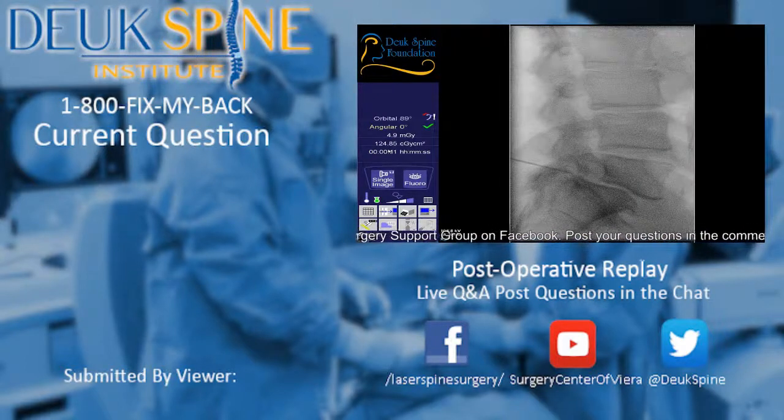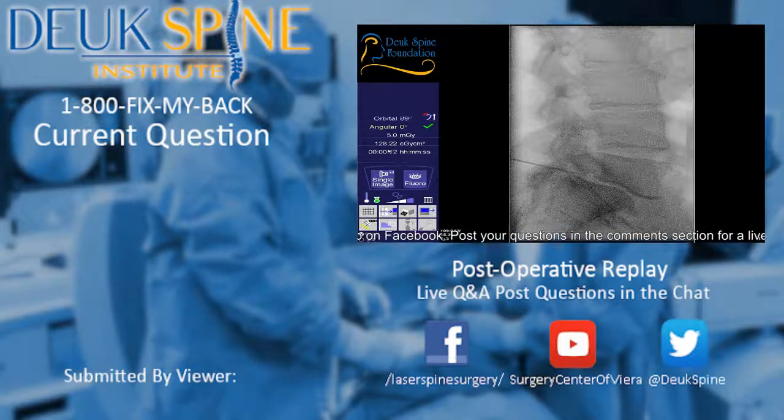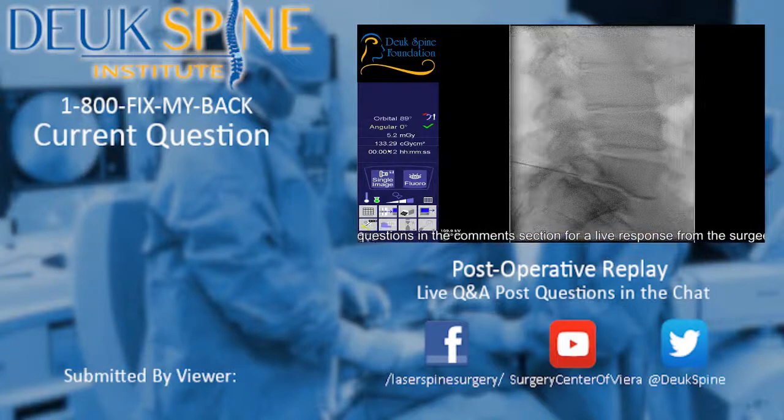By debriding the annular tear, you're now doing a Deuk Laser Disc Repair if you incorporate that into your endoscopic surgery, and you're going to be able to get rid of the neck pain or back pain depending on the part of the spine you're operating on. So neck pain is due to an annular tear, back pain is due to an annular tear. So to be able to get rid of the discogenic pain, which means back pain coming from a disc, you have to debride the annular tear.